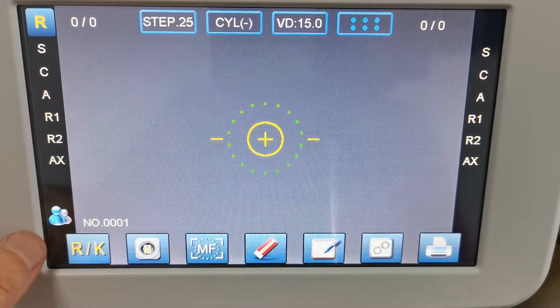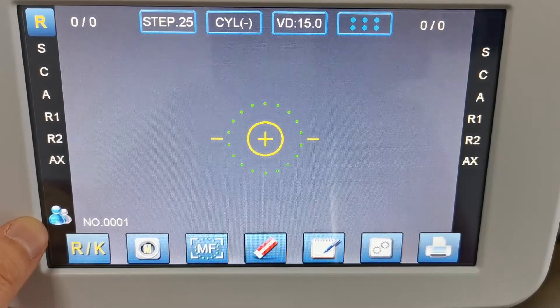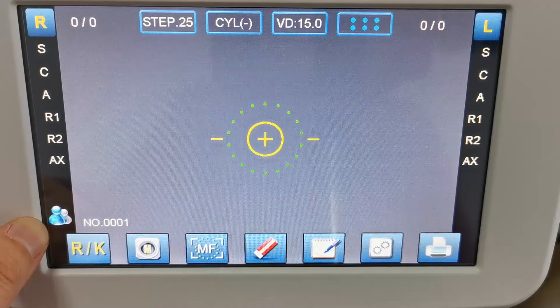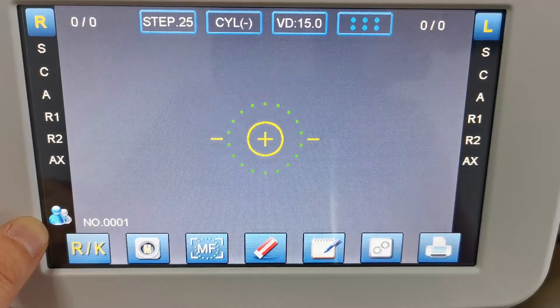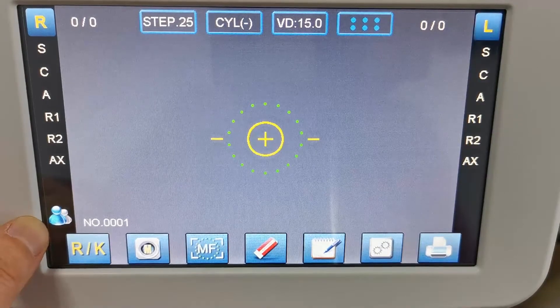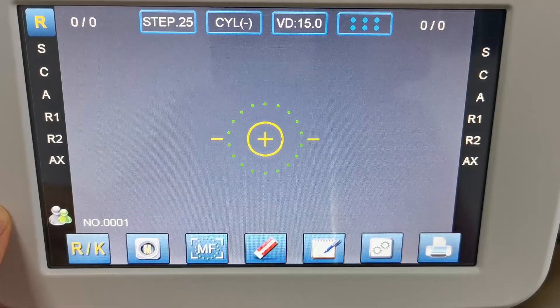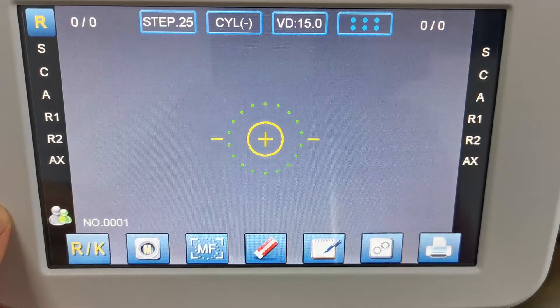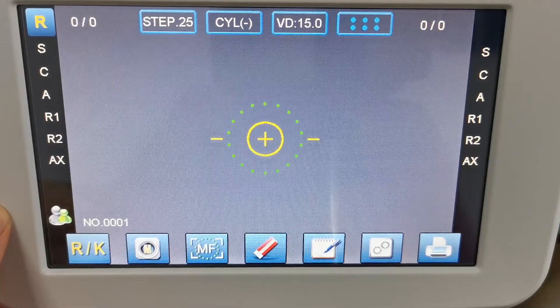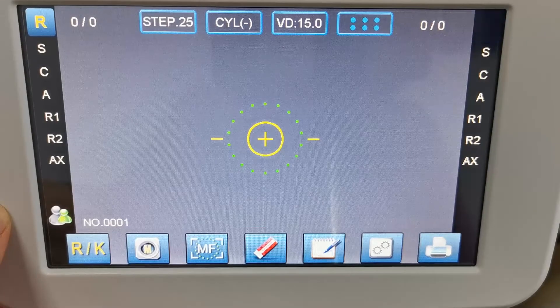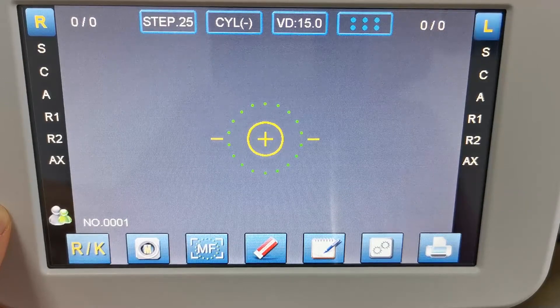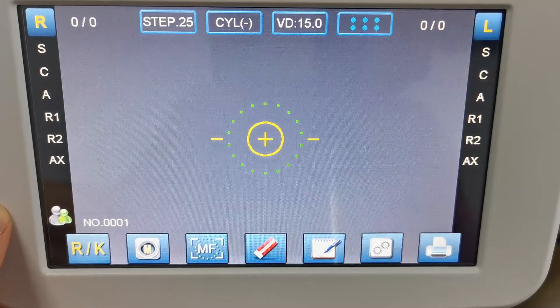This icon is to switch between adult mode and children mode. The blue icon means adult mode and the green icon means children mode. The children mode is for patients who are not so cooperative in the measurement.